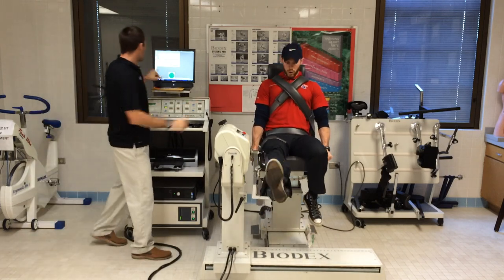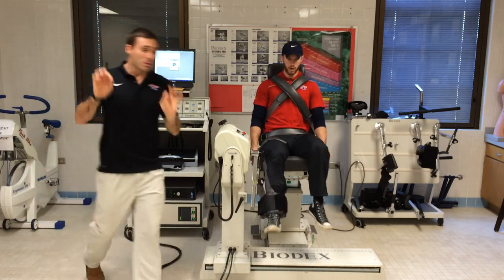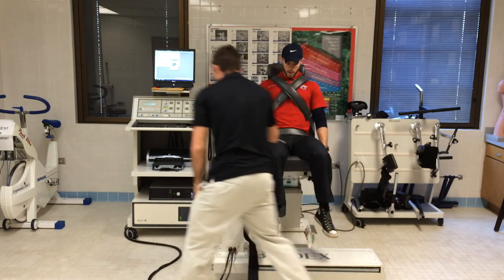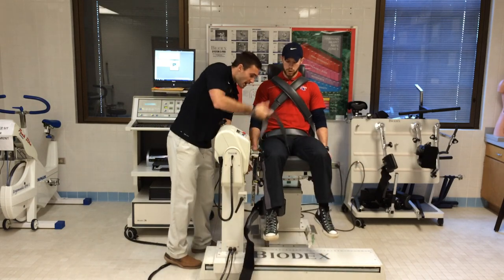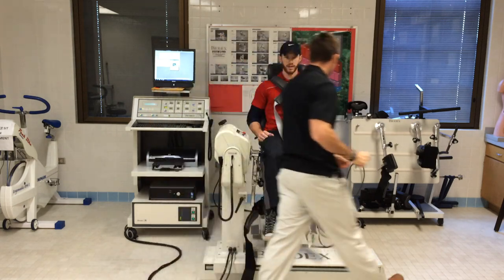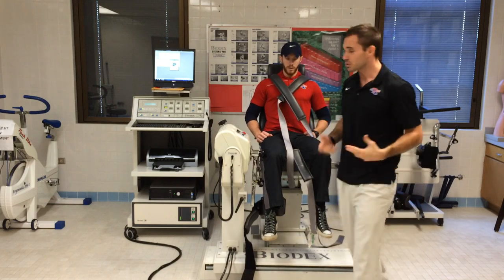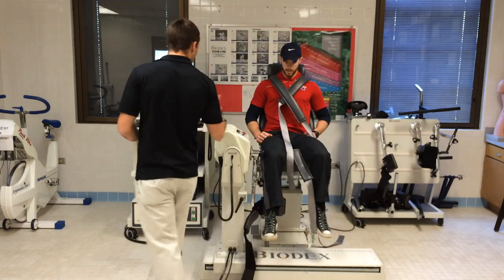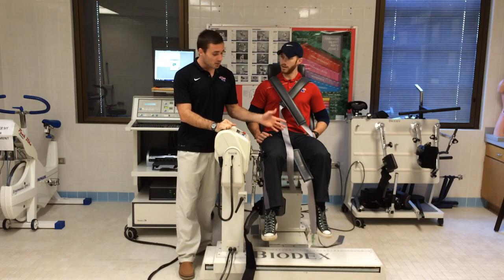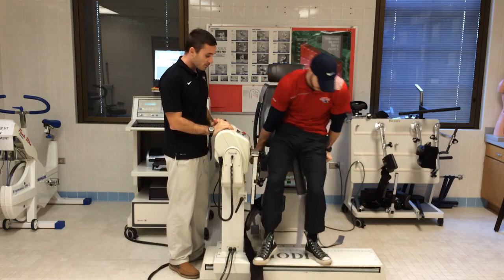And he made it, hits 100%, the computer says go. Immediately what we want to do is get him unconnected from the machine. We get his ankle out, we undo his thigh, his hips, and his shoulders. It sucks when you're done with this particular test. We want to make sure they're free, they're able to relax, they feel okay. When you come out, I want you to be careful, this leg's going to feel a little weird, so go ahead and come on out, but make sure that you are not jumping out too fast, nice and easy.